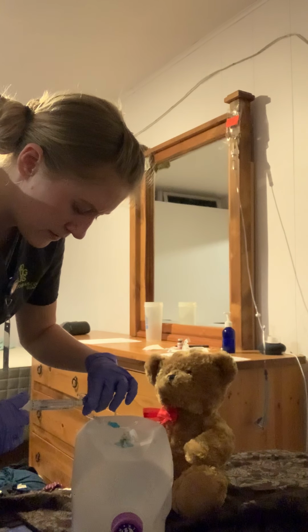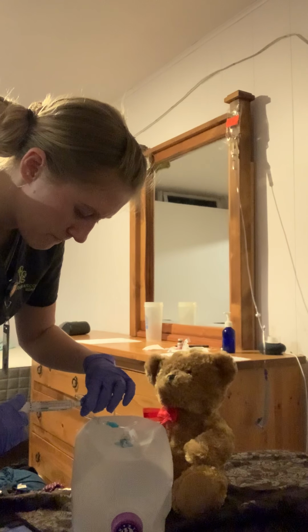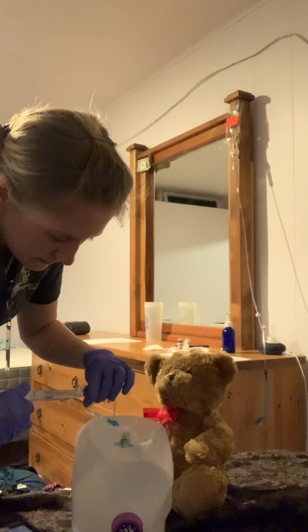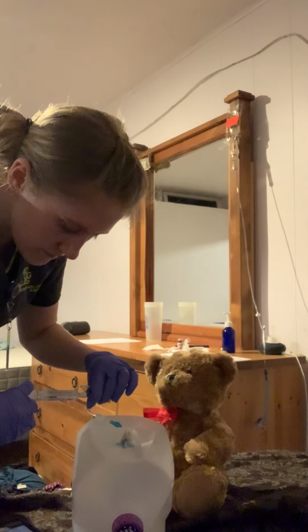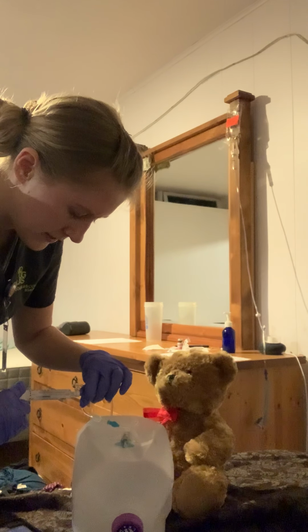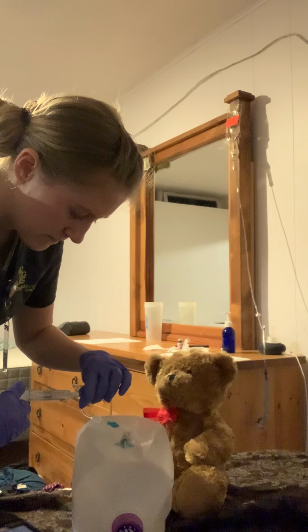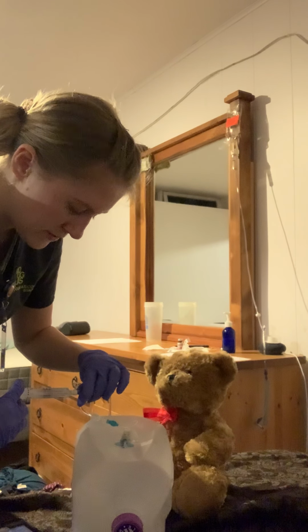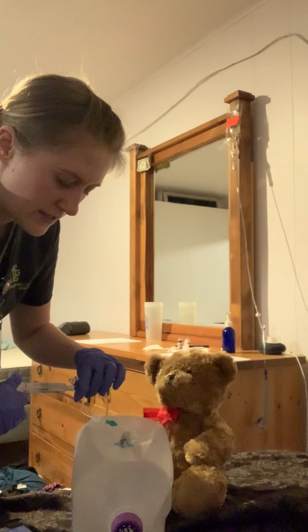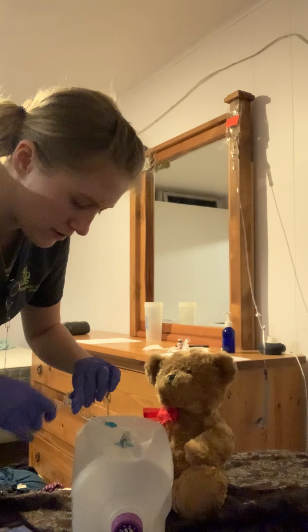So push 1 ml, then stop, that's 30. We'll do another ml. Just checking the patency. All right, 45 seconds, and we'll do 1 more ml. And then we don't have to do all of it. We can just do the 4 mils, just like we did the 4 mils of the medication. And that's a minute, and I'll just unlock that.